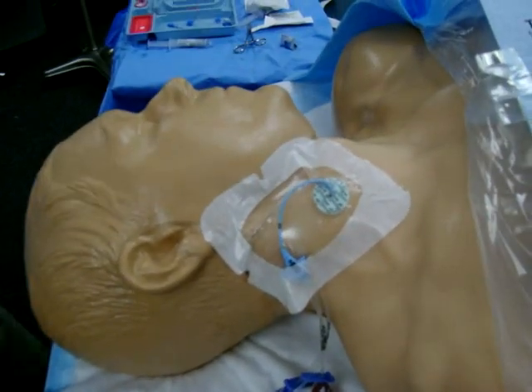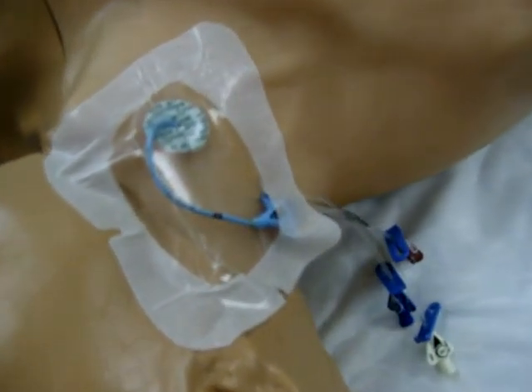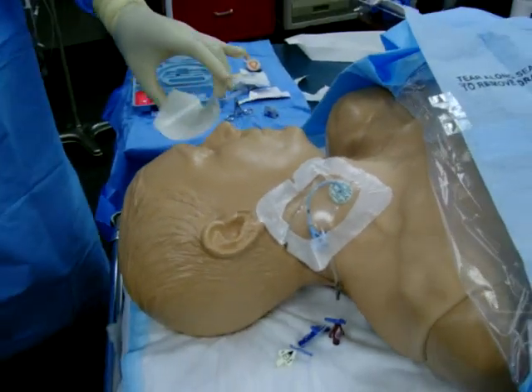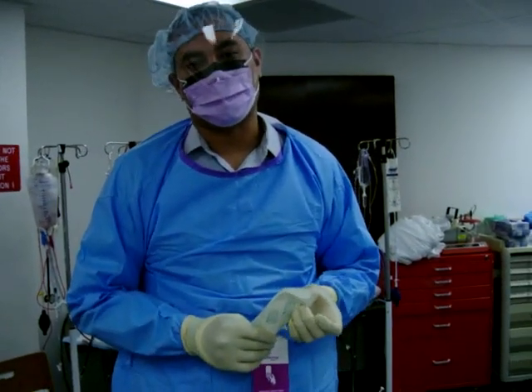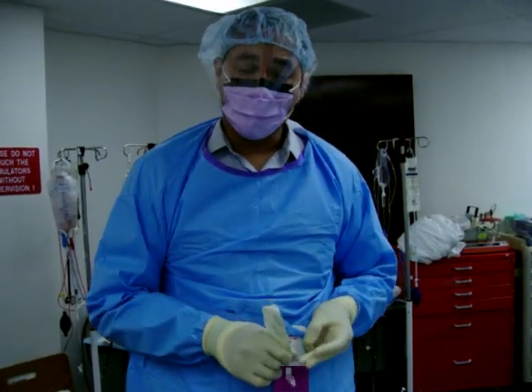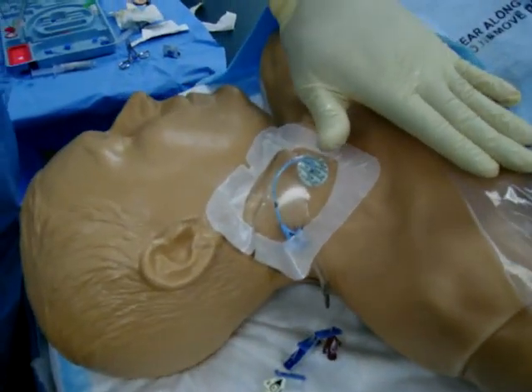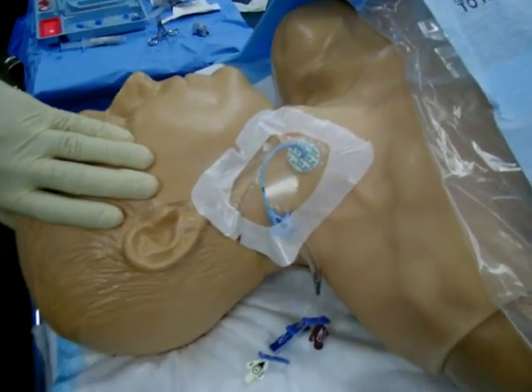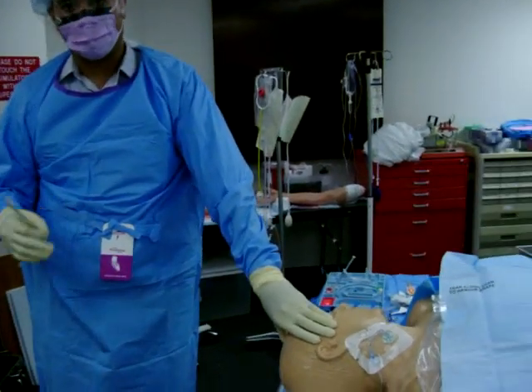The next thing you would do is call for a stat chest x-ray to confirm placement of your line at the junction of the superior vena cava and right atrium. With internal jugular lines and subclavian lines, another risk that you explain to your patients during the consent process is bleeding, infection, and pneumothorax. So you want to be looking closely — if this was a right internal jugular line, when you do your chest x-ray look closely at the apex of the right lung and make sure there's no pneumothorax there. That also confirms placement and then you can give your clearance to use your line and run whatever you'd like through it.